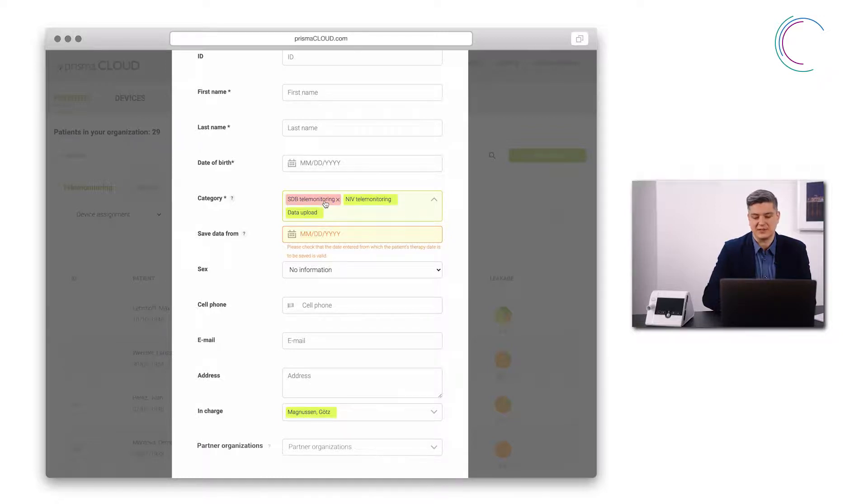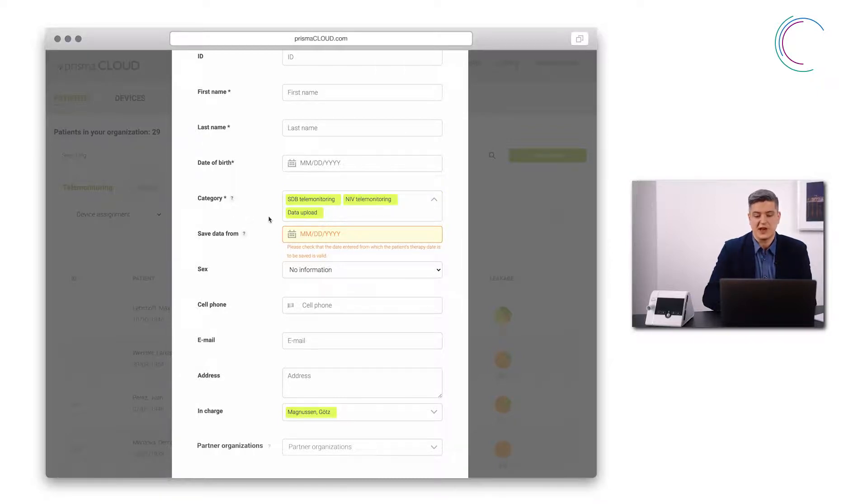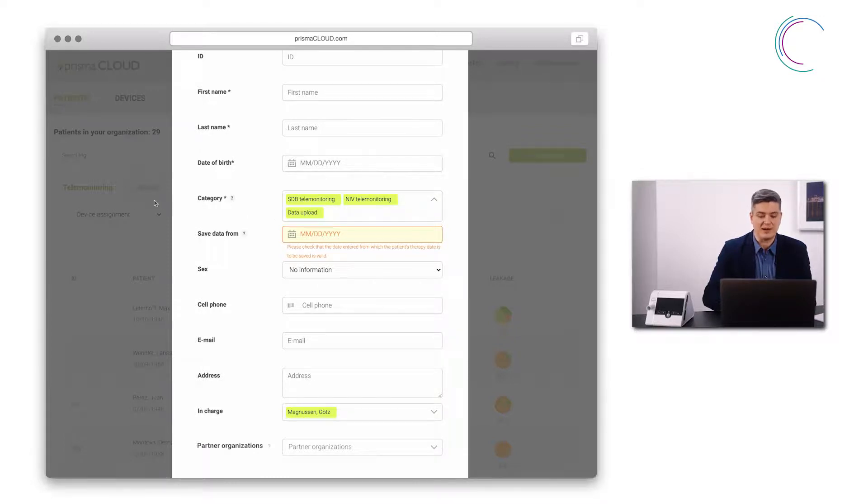SDB telemonitoring and NIV telemonitoring will show the patient under telemonitoring in the dashboard while data upload will show it in the tab upload on the dashboard.